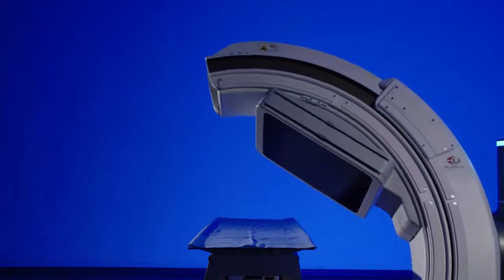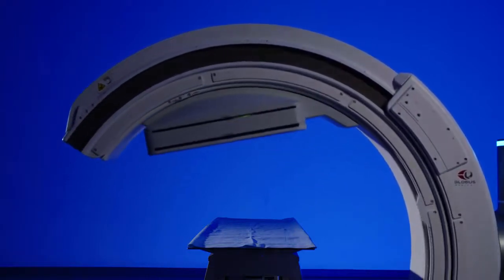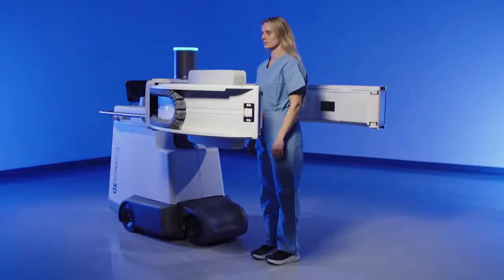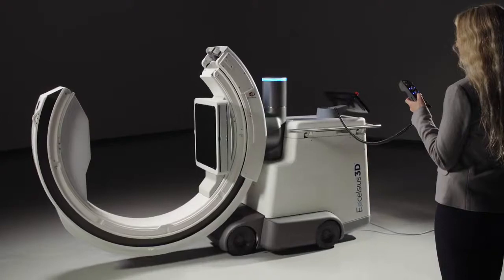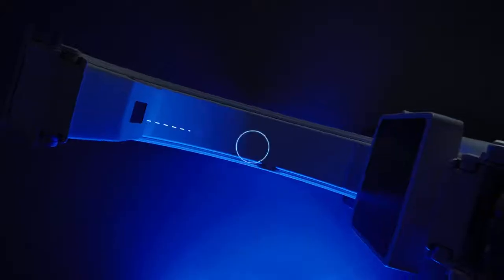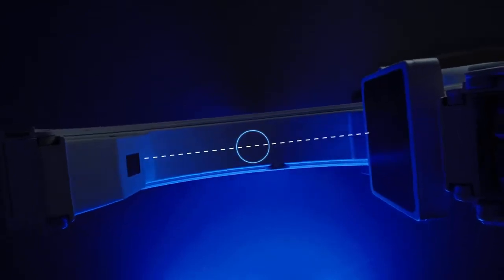The gantry can rotate and tilt simultaneously, such as when moving to an oblique position, and even has the capability to tilt parallel to the floor. Excelsius 3D also features CentroWag, which allows the user to wag about the isocenter of the image, helping reduce fine tuning of system position.